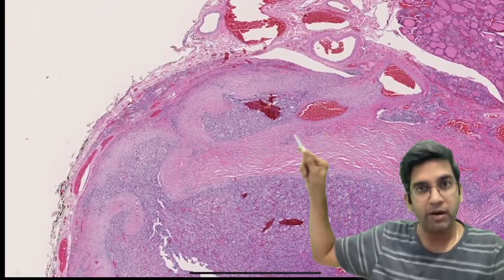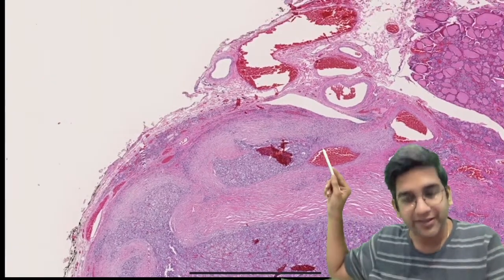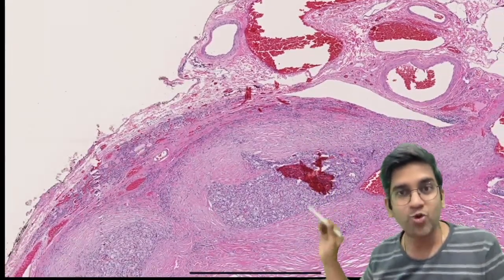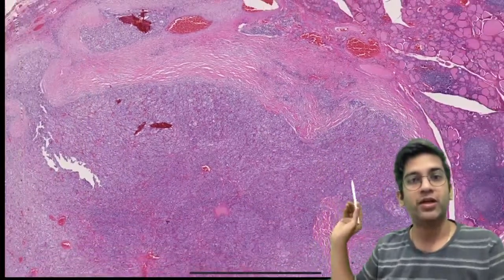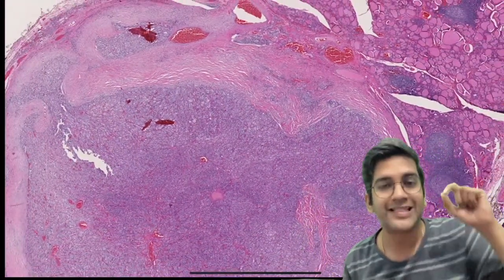I cannot draw on this slide. Tell me which is the normal outline. The one here is a normal outline, or the bump is a normal outline? I want you guys to comment. Keep this as the first one and the other as the second one. Which is normal? One, perfect. The first is the normal outline, which means this other one also looks like capsule only, right? This is not capsule. This is a tumor's desmoplastic response. The normal capsular outline here is, let's zoom out. I'm sure you can see the normal capsular outline. So whatever has come on the top is actually the desmoplastic response.